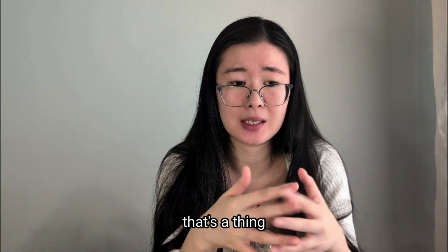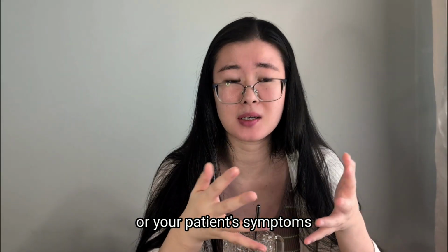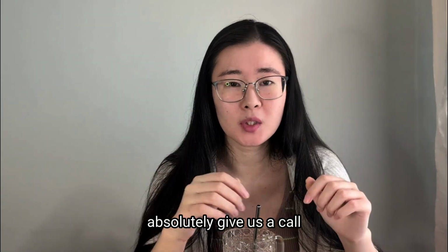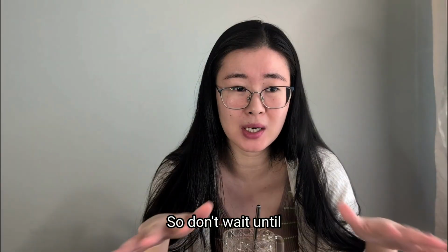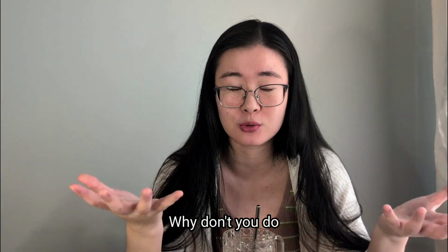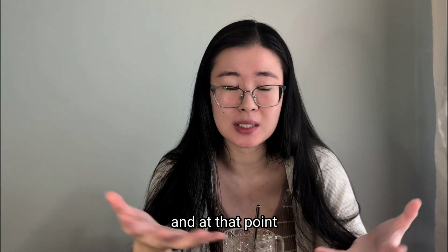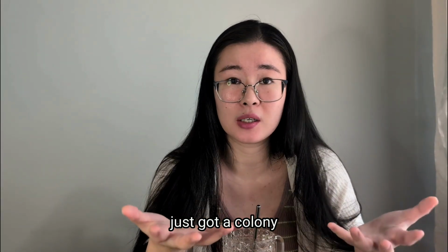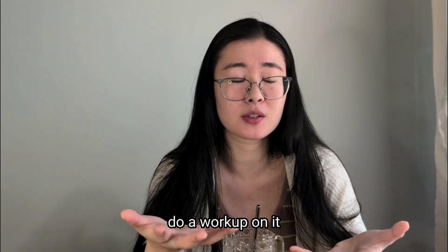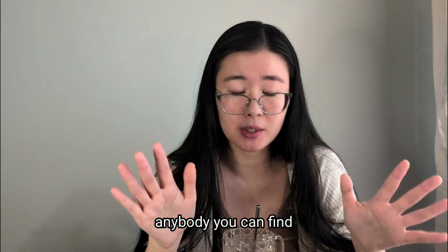So that's a thing. If you have a very specific suspicion or your patient's symptoms are matching at textbook level, absolutely give us a call. We'll figure it out. So don't wait until a week later and then be like, why don't I have a result? Why didn't you do this earlier? They might not have the supply, and at that point they might have barely gotten a colony to be able to have some suspicion and then do a workup on it. So chat with the pathologist on call or the medical director, anybody you can find.